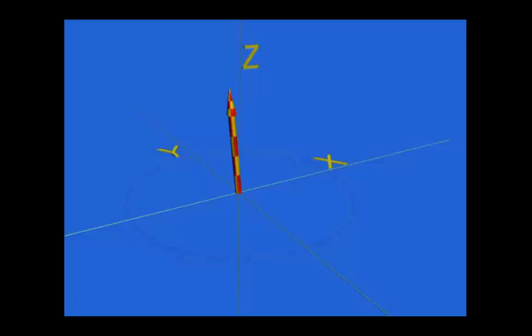In the beginning, the spin vector is facing upward. When activated, the vector is moved down to 90 degrees, then the Z component is decreased, but the XY component is maximized. Then, slowly it comes back to the original status. Here we can get the Z component change by T1 relaxation.